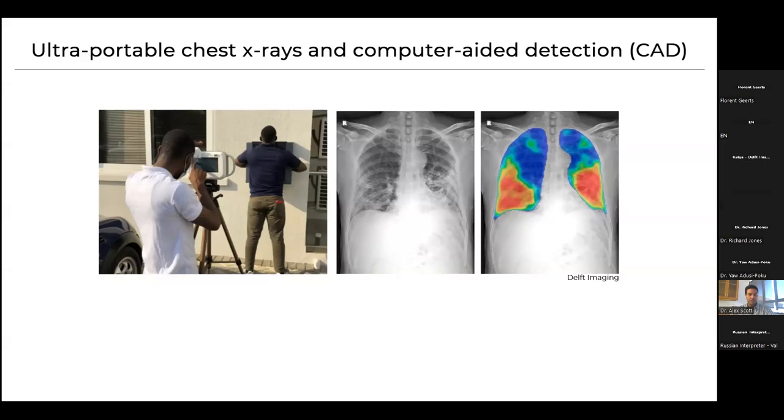We know that Xpert in this setting, in this community-based setting, is an imperfect diagnostic. In our Exact Two study, we showed Xpert sensitivity of around 50% in culture positive TB. And furthermore, there are individuals with a chest X-ray suggestive of TB but negative microbiology. Again, there's lots of modeling work, transmission modeling work, to show that there's a subset of patients that fall into this group where the chest X-ray is suggestive of TB, have a negative Xpert and/or culture, but months or years down the line will develop active symptomatic TB. So how do we incorporate these important aspects into clinical practice and policy decision making?